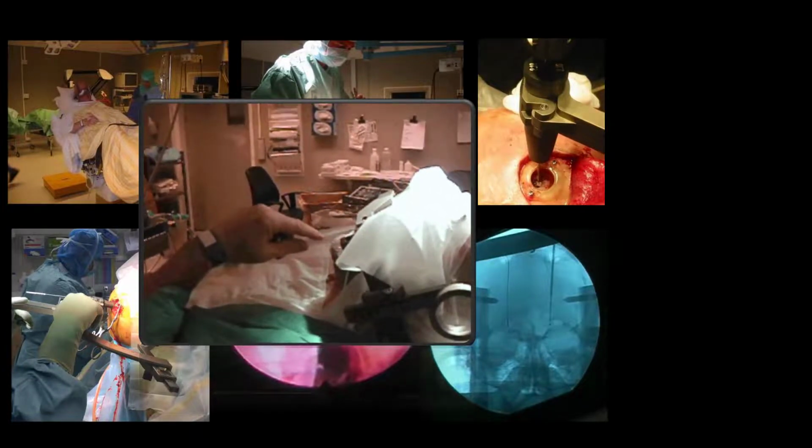If the patient is awake, then the effect can be tested directly during surgery. We see here that he's shaking in his hand and wrist. I increase the current a little bit, and you see he's still shaking in his hand and finger. I increase it a little bit more, and we see that now he's completely still.